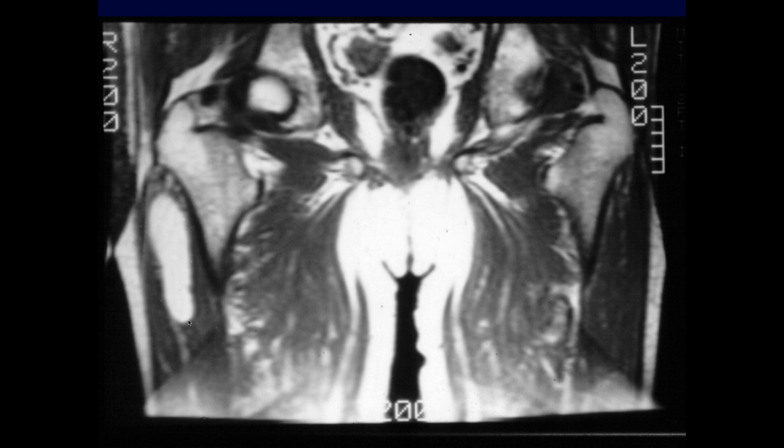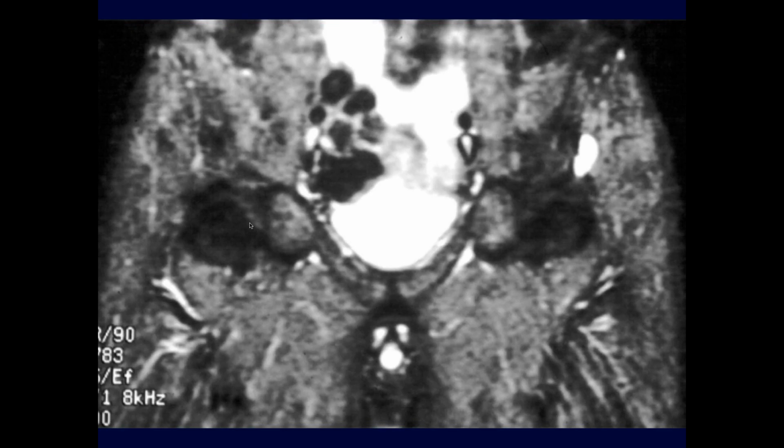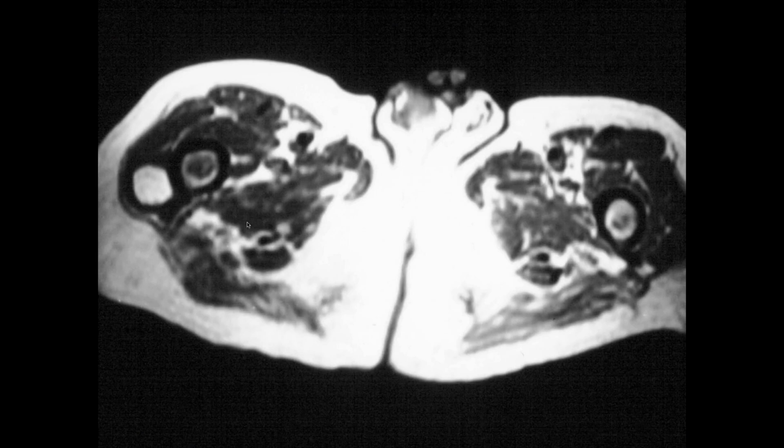Okay, so we have a coronal image through the pelvis, and we can see there's a fluid collection kind of along the right lateral hip. Okay, so it looks more like fat then. So I guess this could be a lipoma. It could also be hemorrhage, acute hemorrhage, if they have recent trauma. This was intramuscular hematoma.